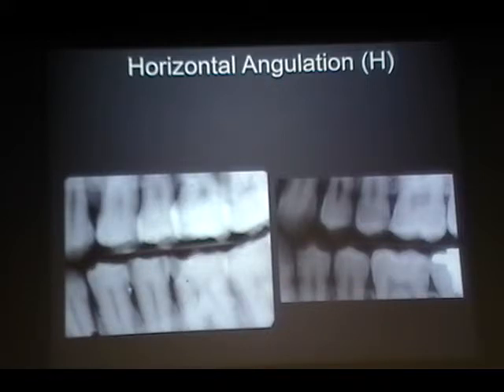If the mouth is pretty small, then in that instance you cannot place the sensor like this, because it's going to touch the anterior teeth. In that scenario, you do end up placing the sensor like this. Then definitely you'll end up getting closed contacts.